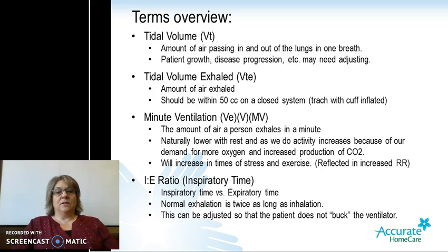Tidal volume exhaled. The amount of air that is exhaled. What goes in must come back out. It should be within 50 cc's on a closed system. A closed system is a trach with a cuff that is inflated. For example, if I had a patient that had 500 cc's of air going in, I would expect to have 450 or greater cc's of air coming back out.